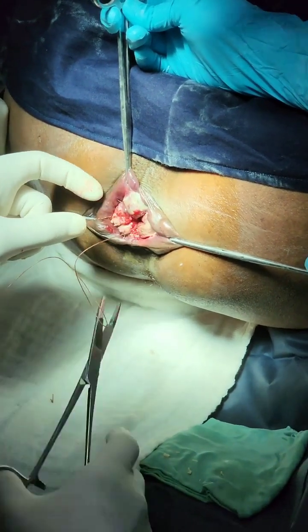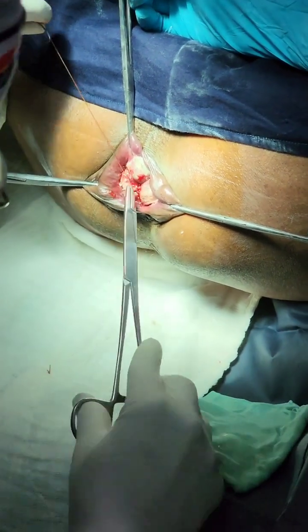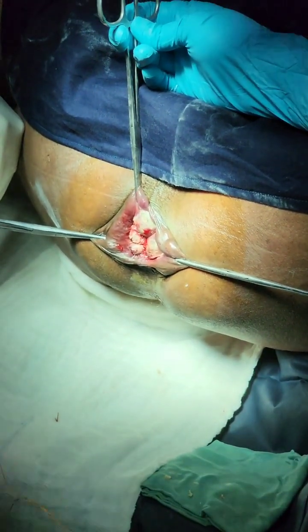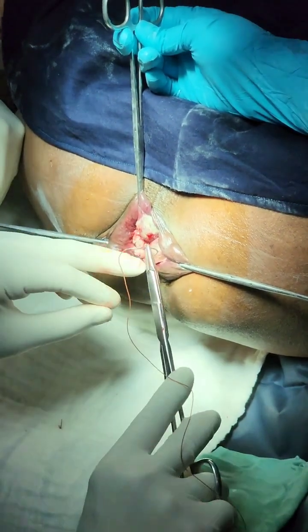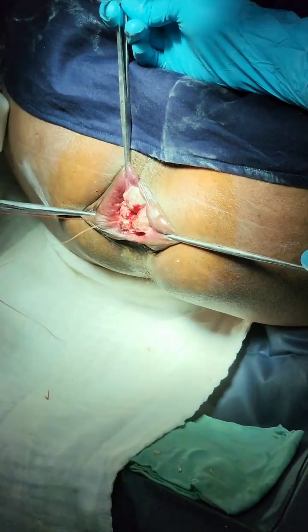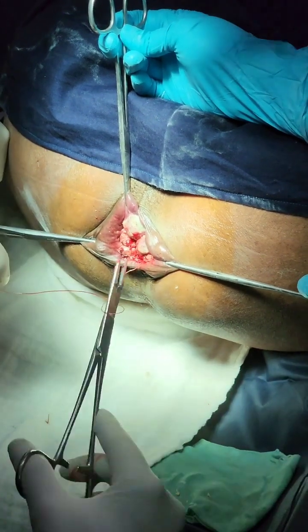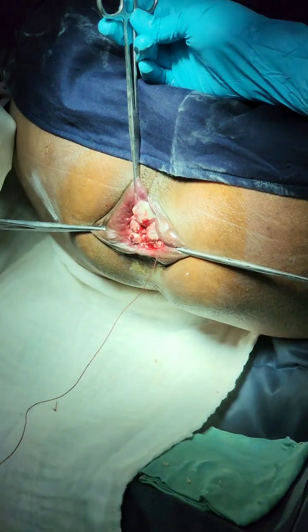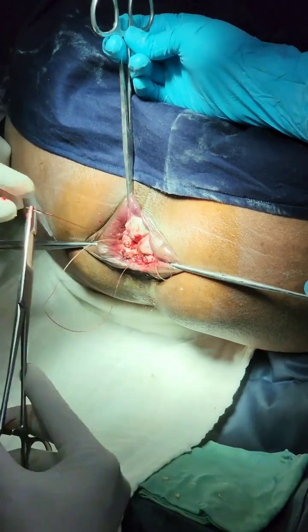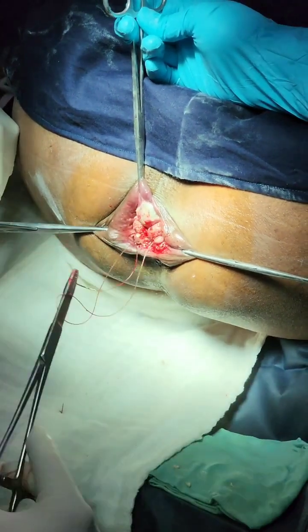First, this particular hemorrhoid is taken care of. Once one hemorrhoid is completed, attention is centered to the next visible hemorrhoid and the same procedure is repeated so as to finish with all the visible hemorrhoids.